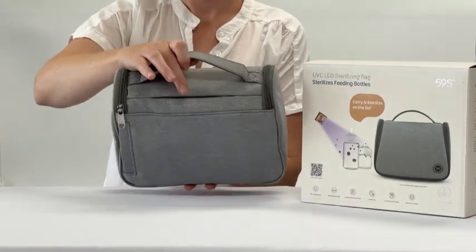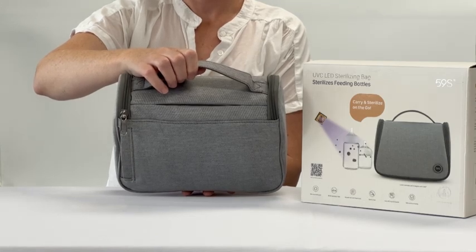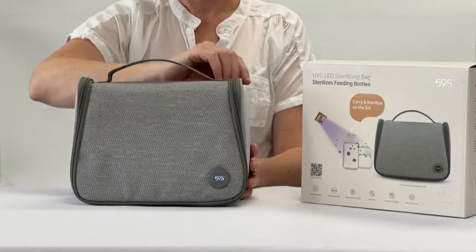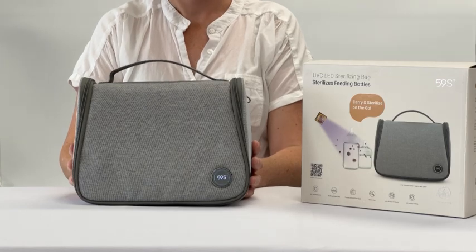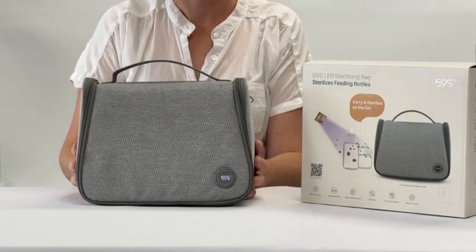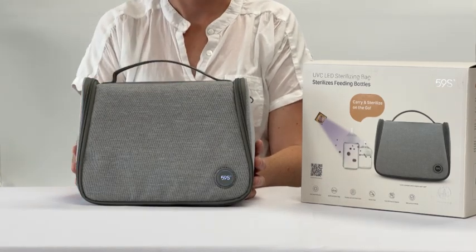There is a peephole window on the bag that shows that the bottles are being sterilized. It also has a built-in safety feature that if you open the bag during a sterilizing cycle it will automatically turn off. If you have placed your bottles in wet, we recommend just drying the bag out with a towel.